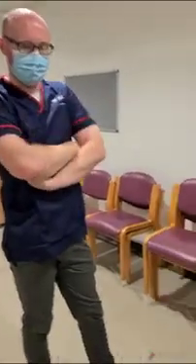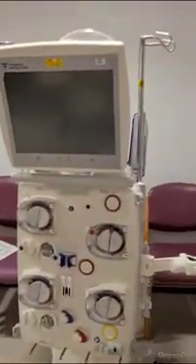Good morning everyone. What we're going to be doing this morning is a quick setup guide for the new Fresenius filters. We've got Rob here from Fresenius himself and he's going to talk us through the machine. So Rob, if I hand over to you mate and you can talk us through what we're doing.